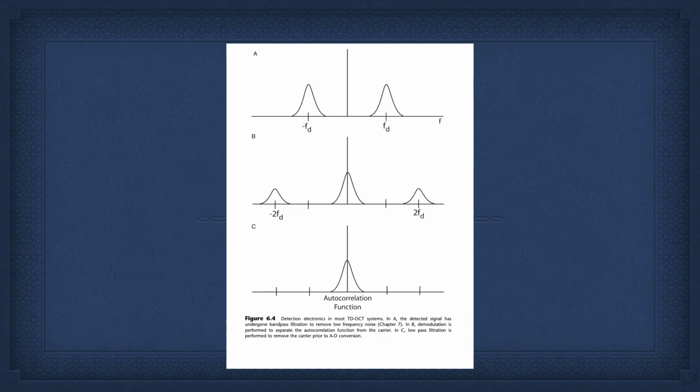But the middle is low frequencies. So if we put a filter right in the middle, now it's been Doppler shifted by that moving mirror, positively and negatively, we eliminate our low frequency noise from, let's say, our electronics. And then we can demodulate and log it.